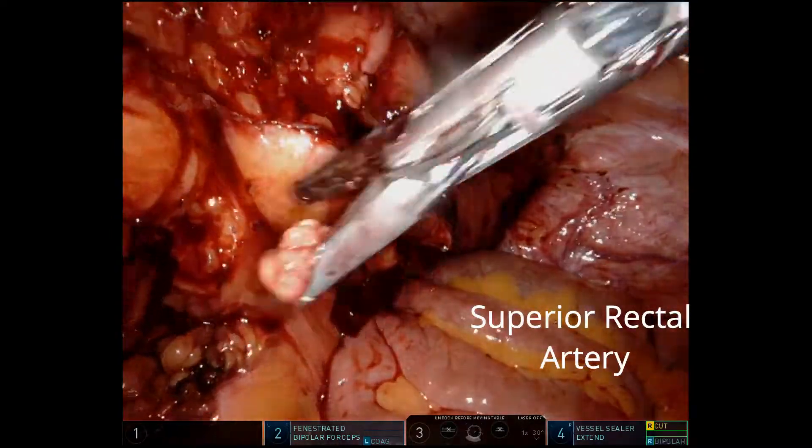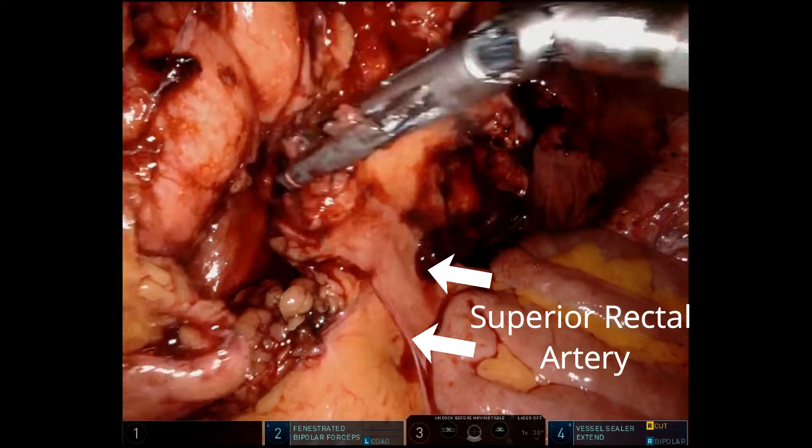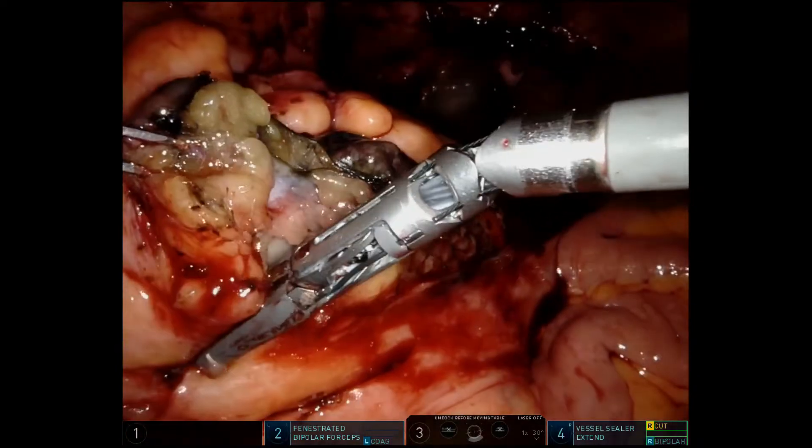We use the vessel seal extend for a nice, smooth division. Now we're going to take down the mesentery. We like to stay close to the bowel — a mesenteric sparing technique. We keep the superior rectal artery intact and avoid the retroperitoneum.